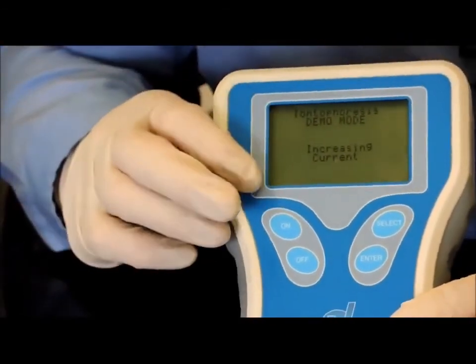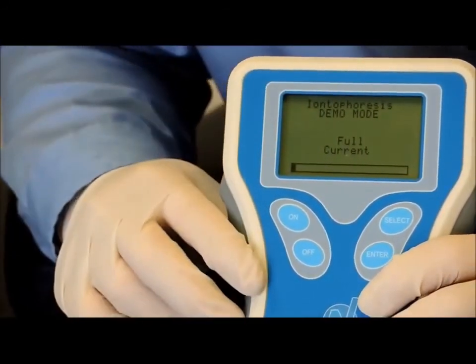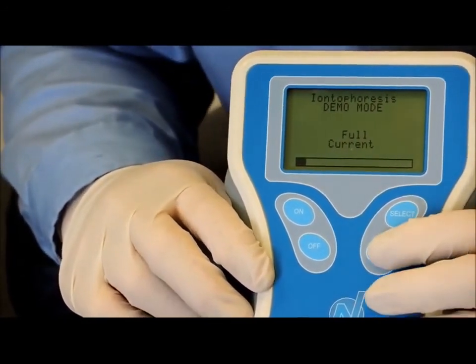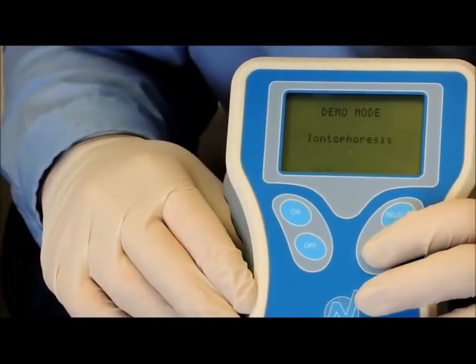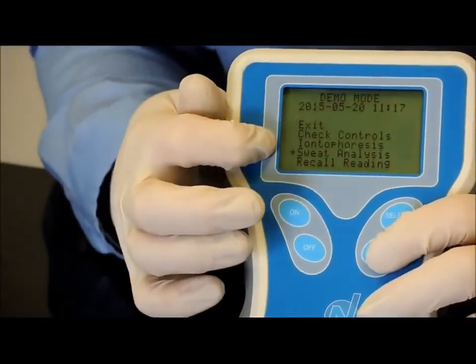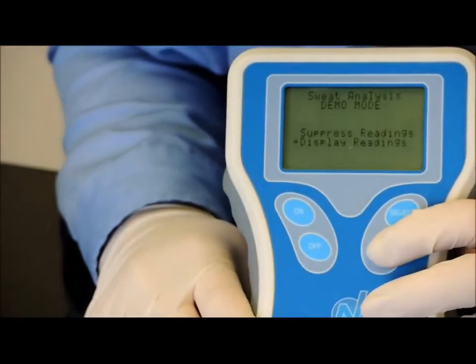So it does the increase in current. I can hit enter and it skips ahead to full current, and with the progress bar, again that would take 2.5 minutes, but if someone doesn't want to take a lot of time, you can hit enter again and it goes to decreasing current. Enter again, it says iontophoresis is complete. Enter again. Now the arrow is down at sweat analysis, and so we can enter into there.